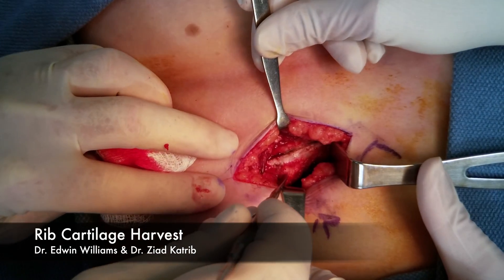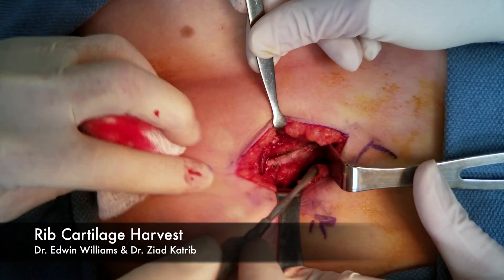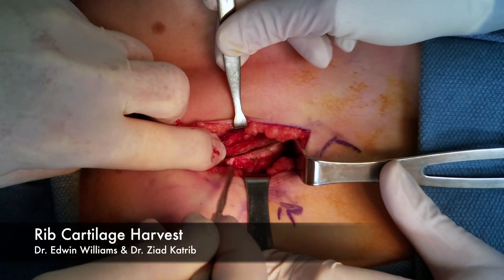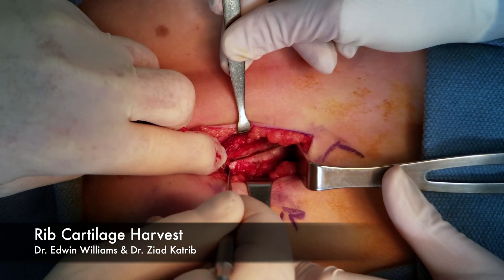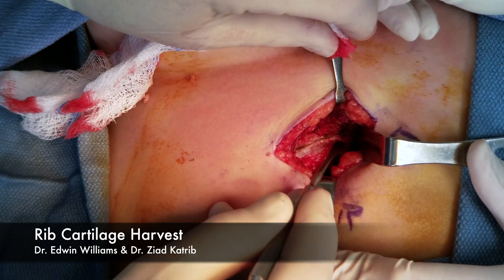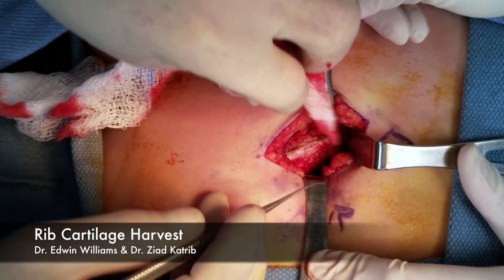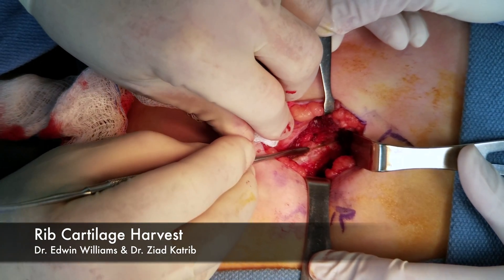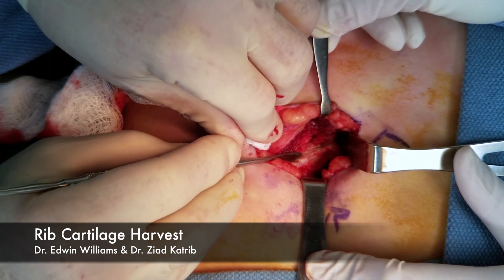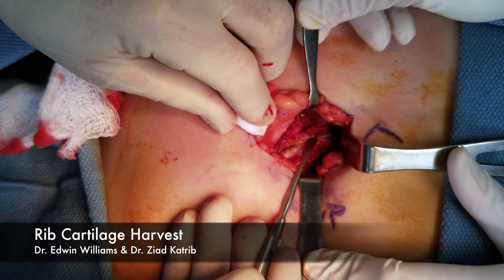So this is probably maybe rib eight here. We like to go as far lateral as we can. We're down to the rib. Make a little cut — a vertical cut in the periosteum. Carry it medially all the way as far as we can. Another little vertical cut so that we have a little H configuration. Then what we try to do is just dissect this off the rib and get around it.